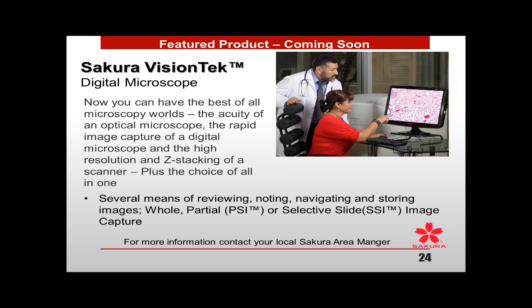At the last Digital Pathology Association meeting, it was noted that primary diagnosis has not been approved by the FDA, but we're all doing ER, PR, HER2/neu, probably some EGFR. There are other things that can be done, such as consulting, frozen section consulting, and consulting on cases already reviewed by a pathologist, but primary diagnosis is not approved in clinical pathology, only in research.